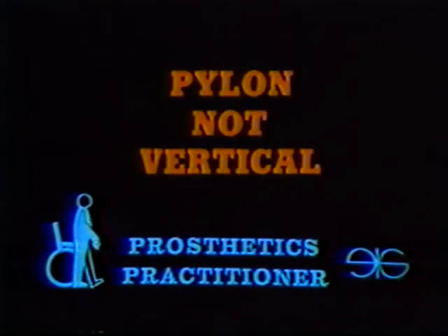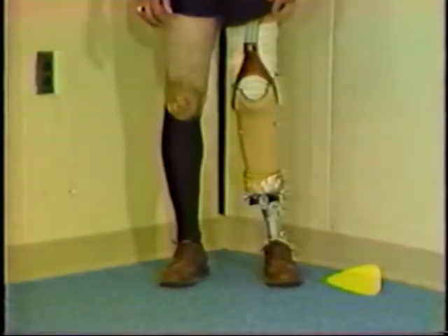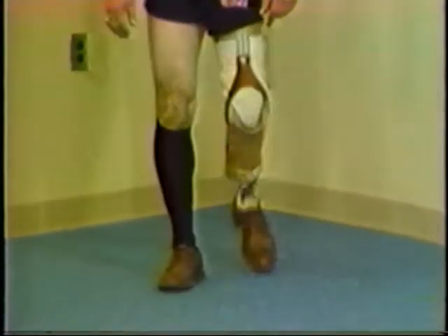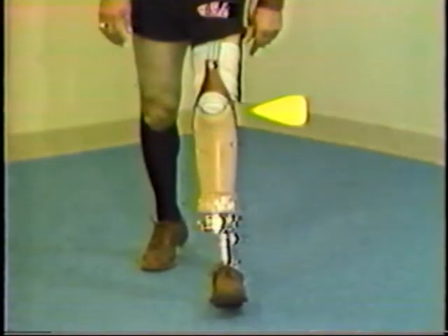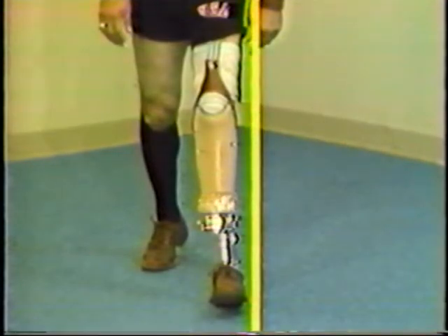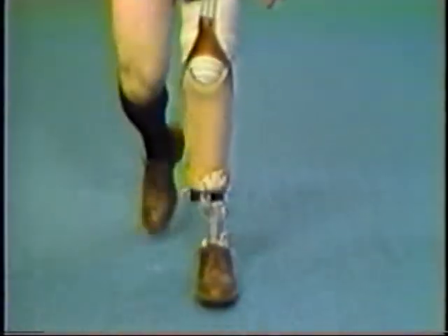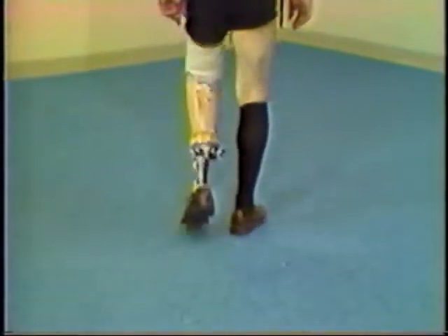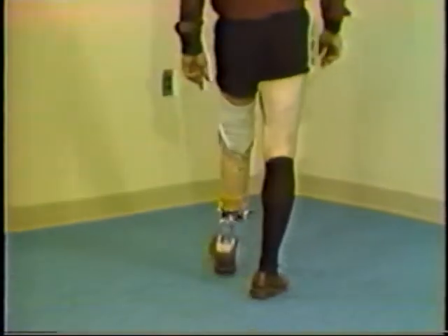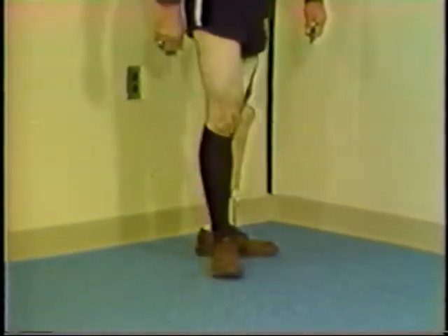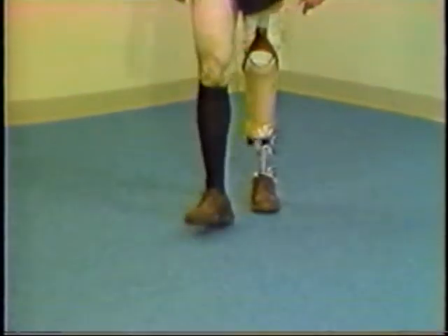The first deviation we will demonstrate is the pylon which is not vertical. As you observe this condition, note that the foot is not flat on the floor. This situation will create excessive socket pressure on either the proximal or the distal portion of the residual limb. The pylon is not perpendicular to the ground and the foot is not flat on the floor at mid-stance. This deviation can be caused by an improper tilt adjustment on the adjustable leg, the foot being too far outset, or the limb being too long. The pylon could tilt the opposite direction also to cause this deviation.